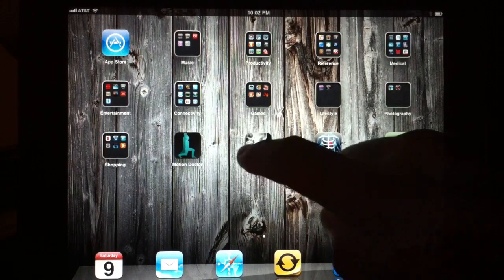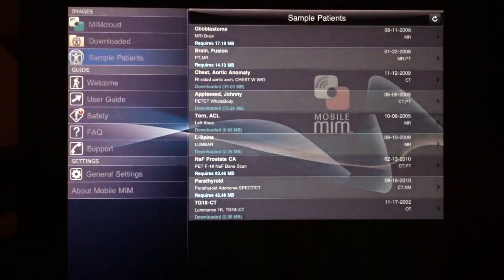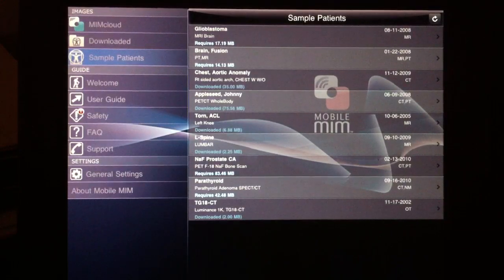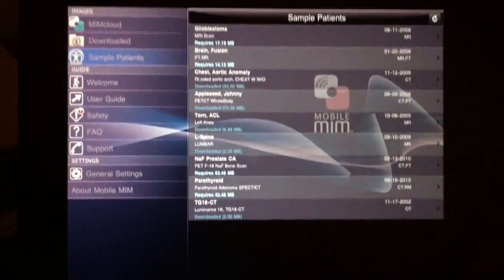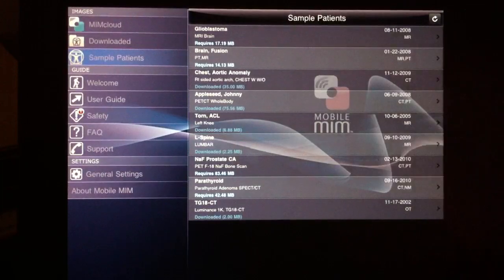This is a brief demonstration of the Mobile MIM iPod Radiology Viewer. When you first log in, the first thing you notice is that there is a list of options on the left and on the right are the studies.